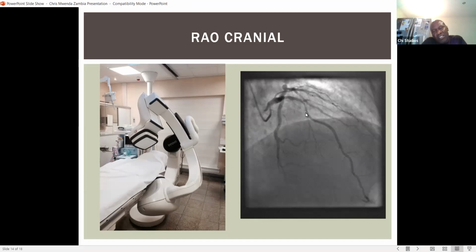So in this case, we intervene, and we can use a stent. A stent is a scaffold. What will happen is you will put a wire in here and balloon this area. When we balloon, we use a special balloon meant for cardiac arteries. When you balloon, you open it up, and then you put a stent. A stent will be permanent in the patient's heart. It keeps the artery open. The patient is usually put on aspirin for the rest of their lives, obviously to prevent restenosis, whereby the blockages come back if patients are not looking after their stents. That means not taking their medication after the PCI, after the procedure is done. Okay.